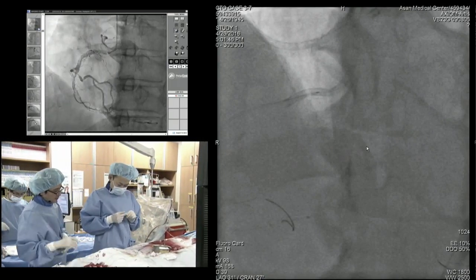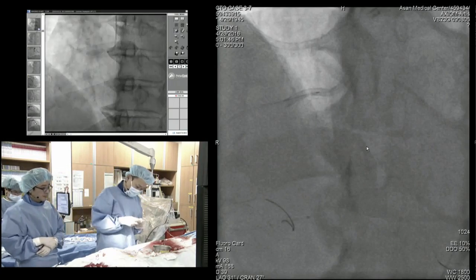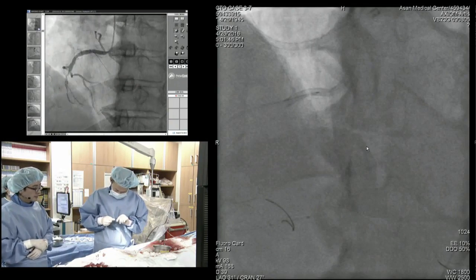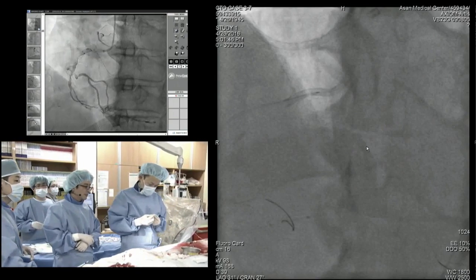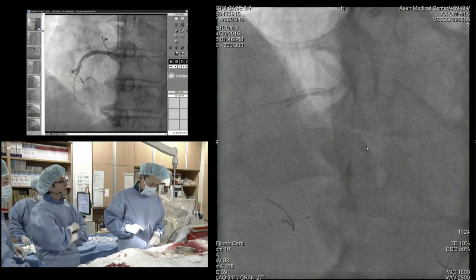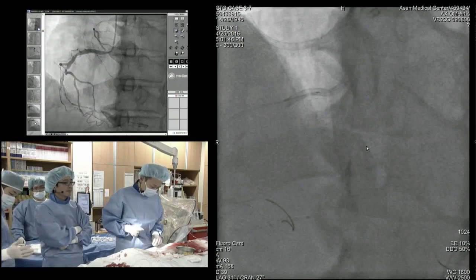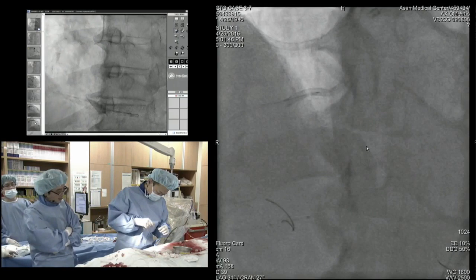So Sasuke will pass. But unfortunately, I don't have Sasuke today. Please explain Sasuke, because this is in Korea. Sasuke is a double lumen catheter from Asahi Intecc, and maybe someone will explain it tomorrow in the CTO session.